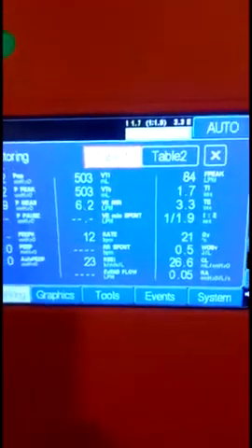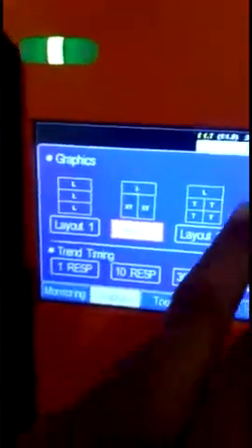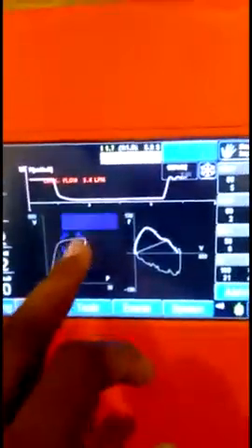If you want to see the advanced monitored parameters, you just press the monitoring button, and all the advanced monitoring parameters will appear on a single screen with a single touch.